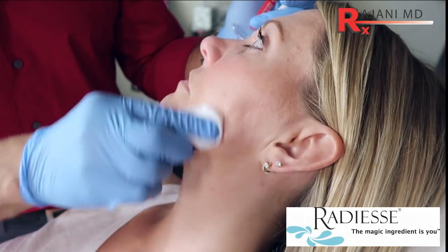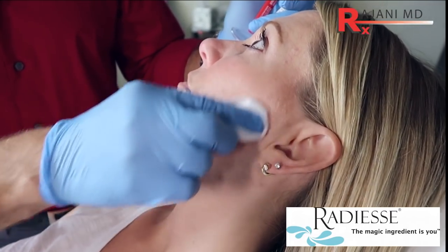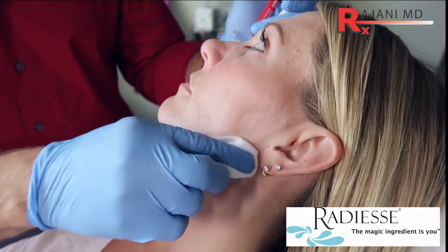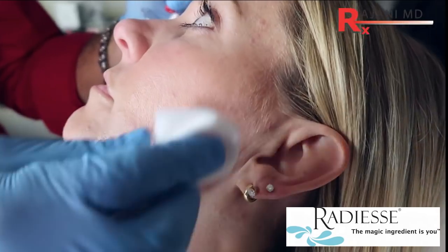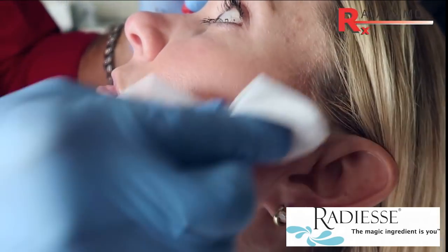It's important to cleanse the area. There's a lot of controversy over what we're using now — hypochlorous acid, peroxide, and alcohol. Some people use Hibiclens. It's important to cleanse the area — that's the key — and cleanse several times.